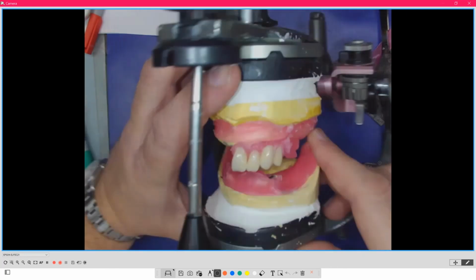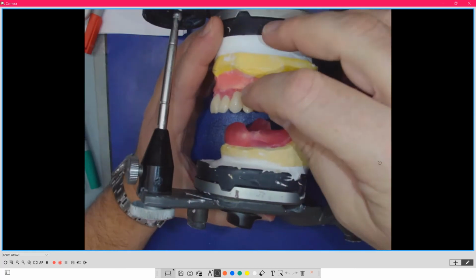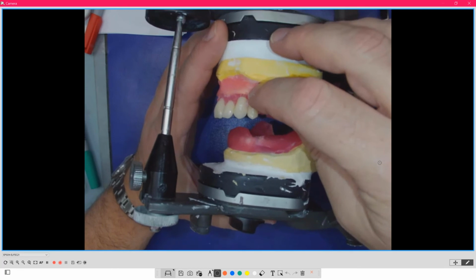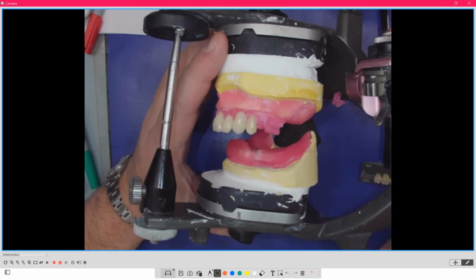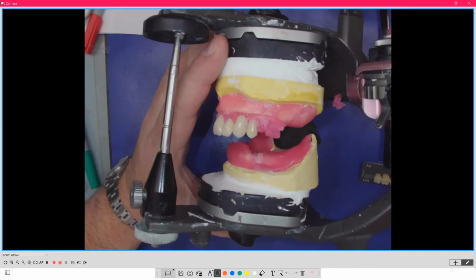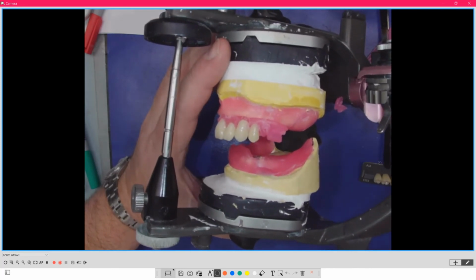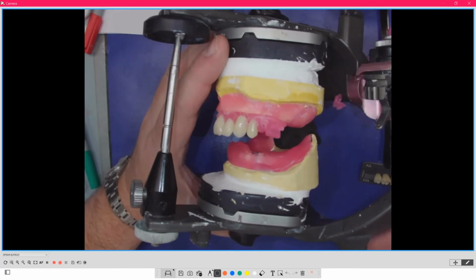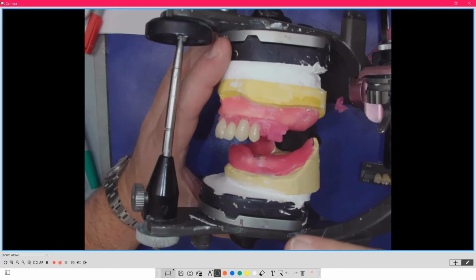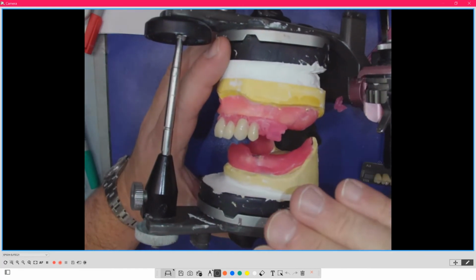Okay, so what we're going to do is, again, we set the first bicuspid. So I'm going to start here for everyone. So VITA teeth are very flexible. You can set all the uppers first, or you can set all the lowers first. You can set them to a flat plane. You can set them to a curved 20-degree template. You can set them to a customized template. It doesn't matter. It's all going to work because, again, these teeth are not locked in. They have that flexibility and freedom.